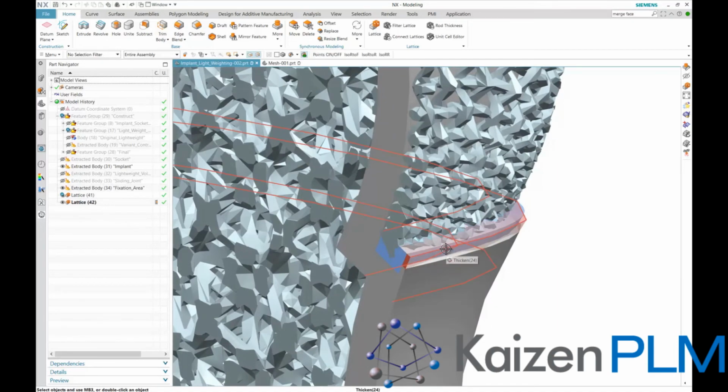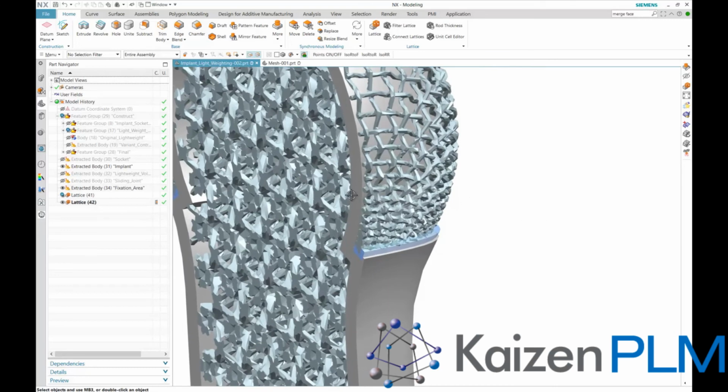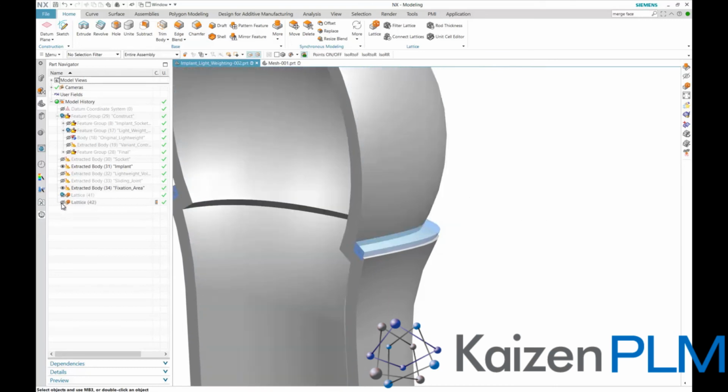Finally, in this demonstration, we will add a lattice to the implant that will help fixating the joint or seam area between the implant and the polymeric surface. Doing so, we will see that the randomize option has been improved and from this version of NX does not extend outside the fill volume.